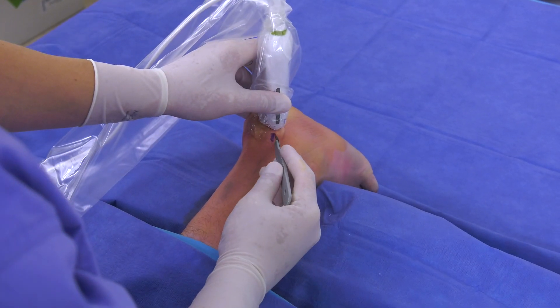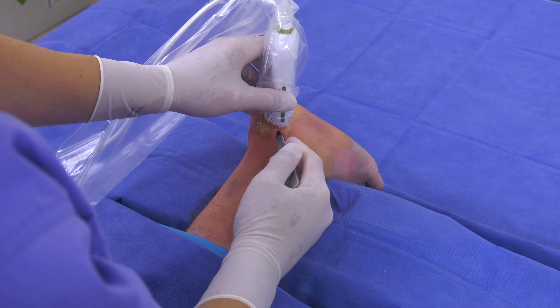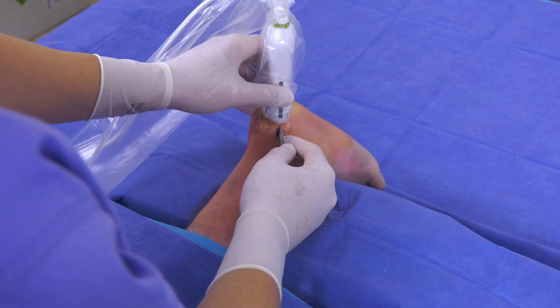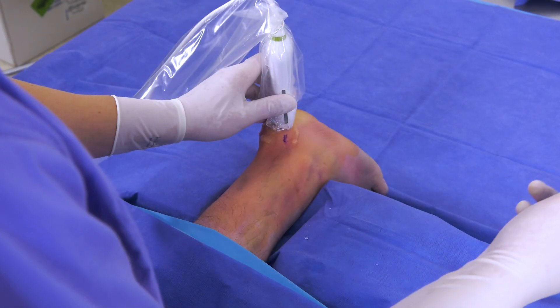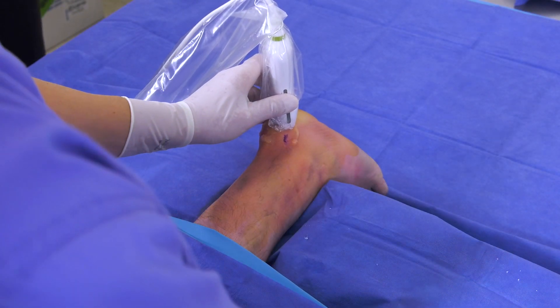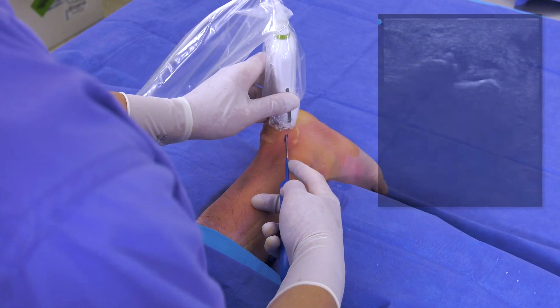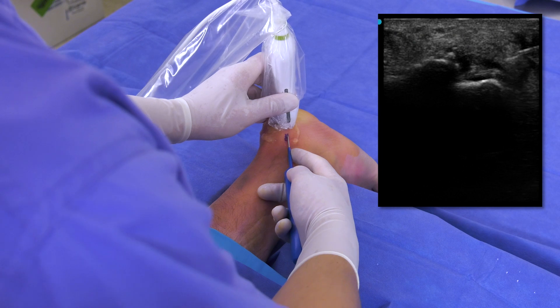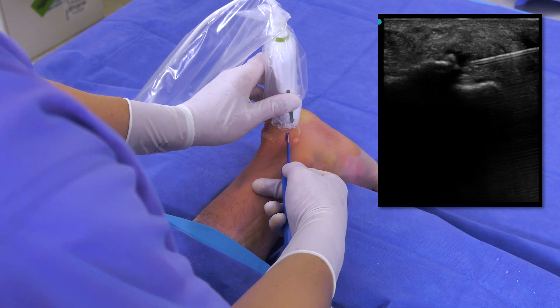Using an 11 blade scalpel I make a stab incision in order to create a pathway for the TenJet device down to the insertion of the Achilles. Once I have created this pathway I can guide the TenJet device toward the pathology while visualizing it under ultrasound. When the device is in the proper position I depress the foot pedal.